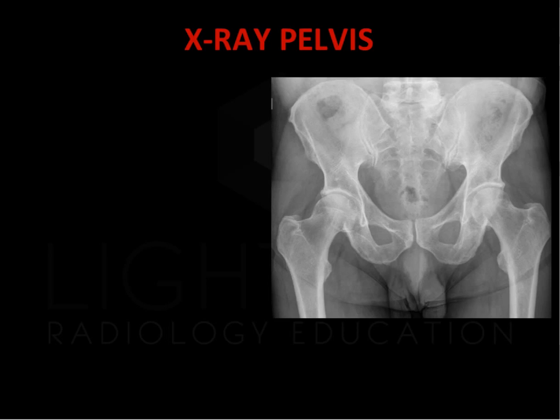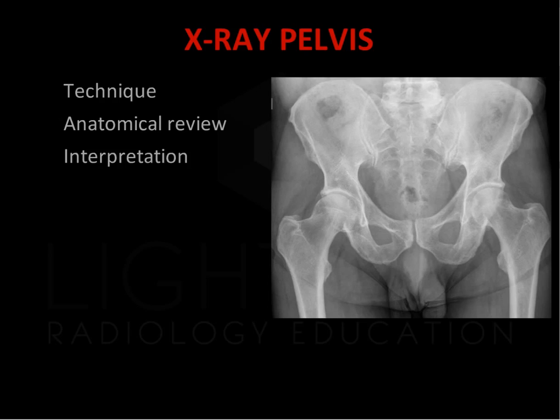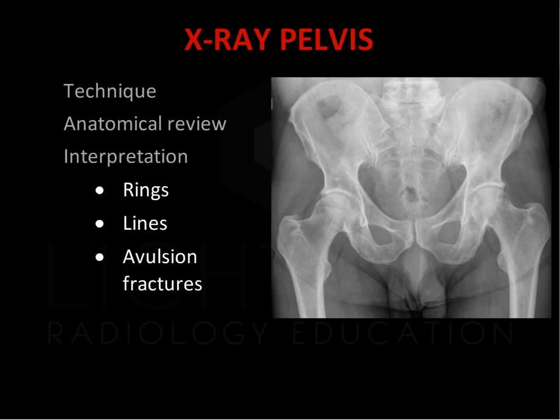This concludes our review of the pelvic X-ray. We have discussed radiographic technique, reviewed normal anatomy, and discussed the basic principles of interpretation. We have outlined assessment of the main and obturator pelvic rings, pelvic lines including the sacroiliac joints, arcuate lines, pubic symphysis, iliopectineal and ilioischial lines, and acetabular lines, and discussed avulsion fractures in the adolescent population.